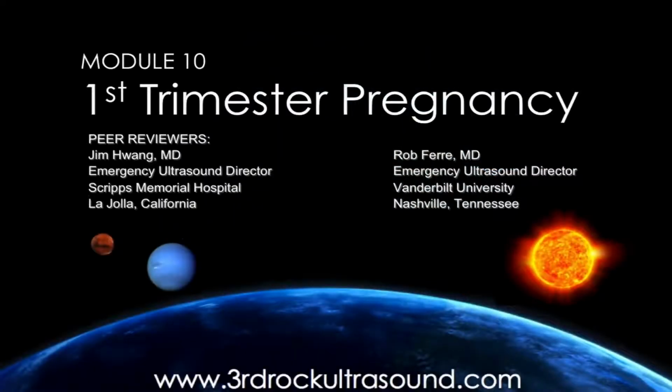This is Module 10, First Trimester Pregnancy. Ectopic pregnancy is still one of the leading causes of maternal death, but ultrasound has dramatically decreased the morbidity and mortality of this disease. This module will help you use ultrasound to manage first trimester pregnancy complaints.